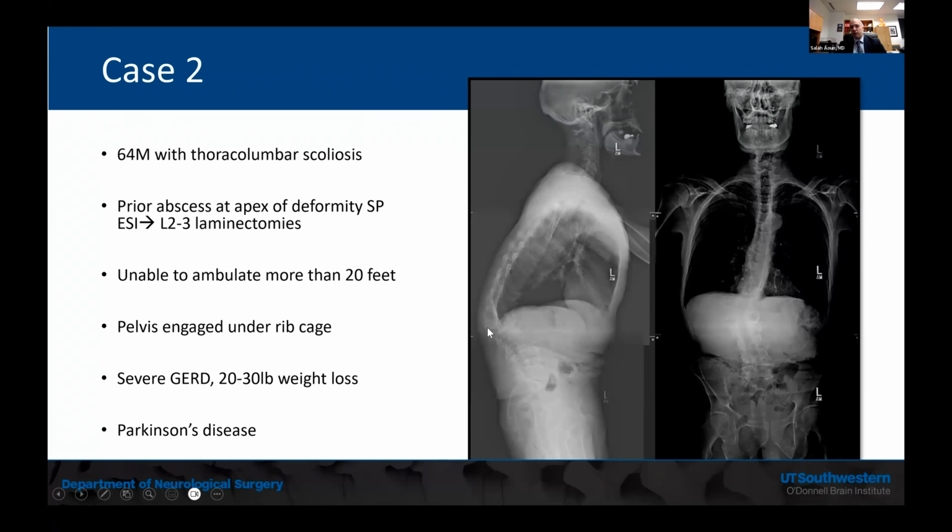So this time we printed his pelvis as a whole and as a life-size model because he also had 6 lumbar vertebrae. So now you have a patient with neuromuscular scoliosis, abnormal anatomy with 6 lumbar vertebrae, a prior laminectomy. So a model like that would have been very useful. He also had an abnormal sacrum at the top, so the sacral foramina were irregular.